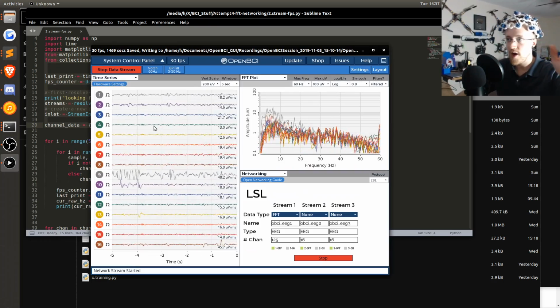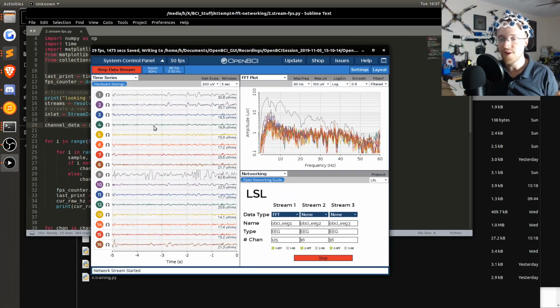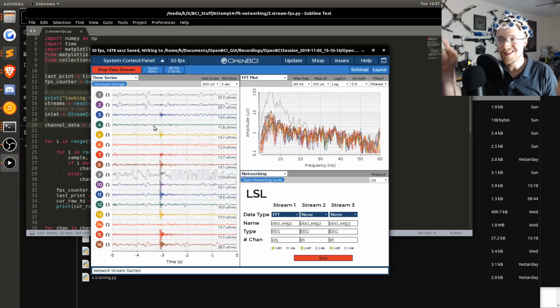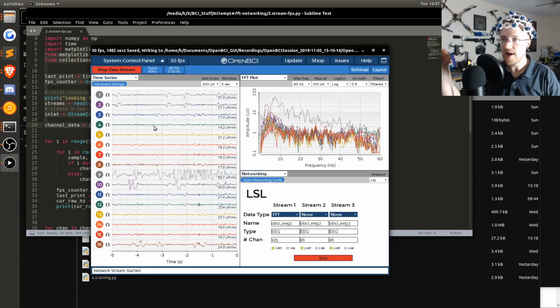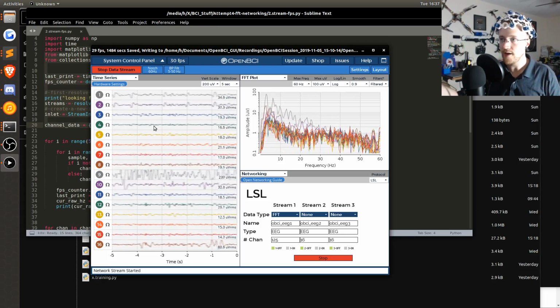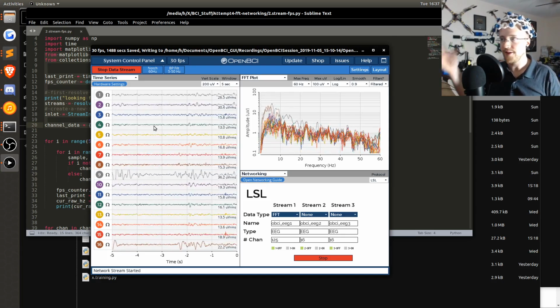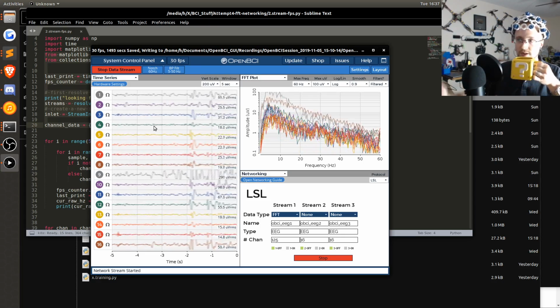You just leave this UI up, and it's just streaming that information, which is super useful because if you've ever had to work with serial connections to things, it's kind of a pain in the butt, and very often you're just cycling power over and over and over. It's very hard to iterate on the code. There's usually clean ways to exit, but often you'll hit an error or something like that, and it's a pain. So this is super cool because you don't have to deal with that.